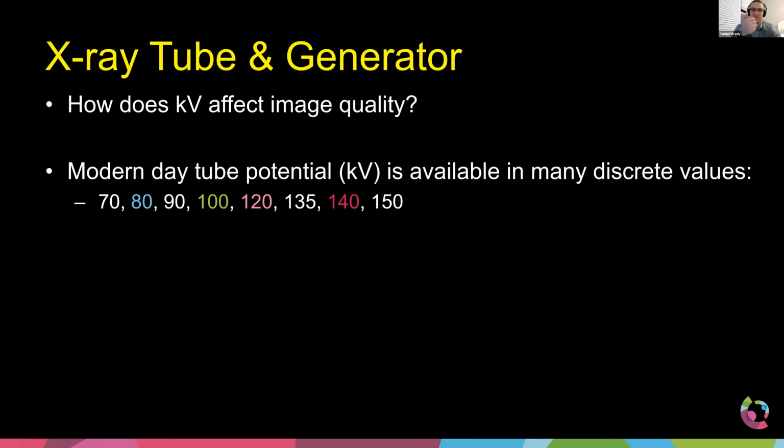That is one of the fundamental things that are already set. So that's usually something the technologists don't change, which I'm not 100% certain how they do it in Thailand, but I can vouch for what I see here in the US, as those are all predetermined in the protocols that are built by the optimization team.